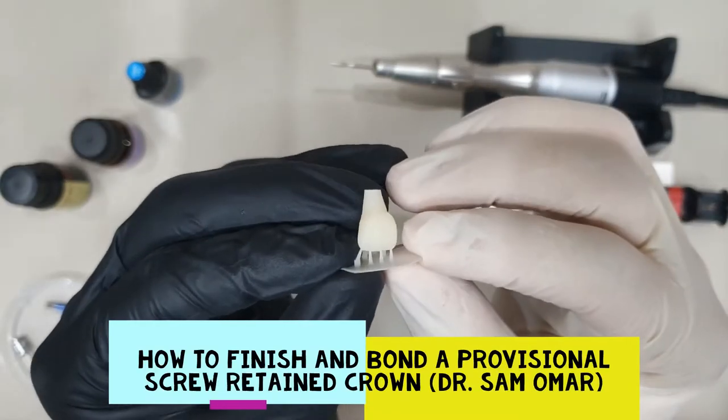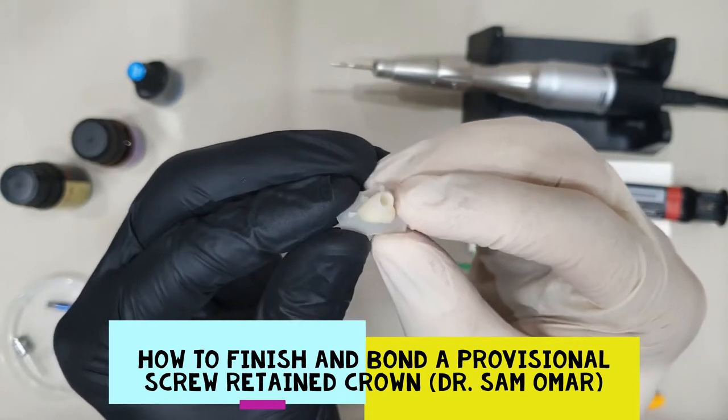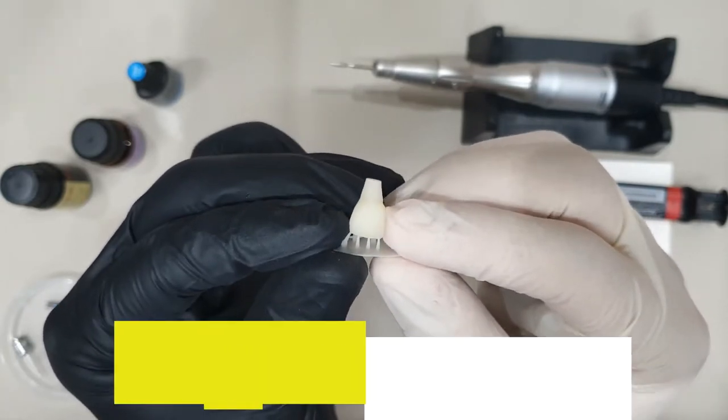Hello everyone, this is Dr. Sam Omar, and in today's video we're going to show how to finish an acrylic crown after 3D printing.